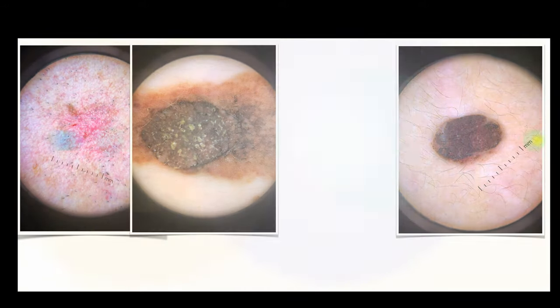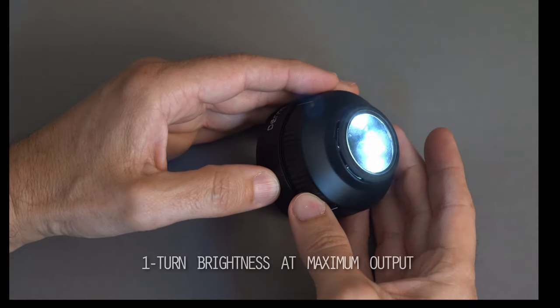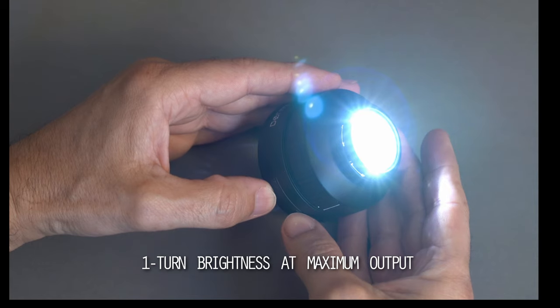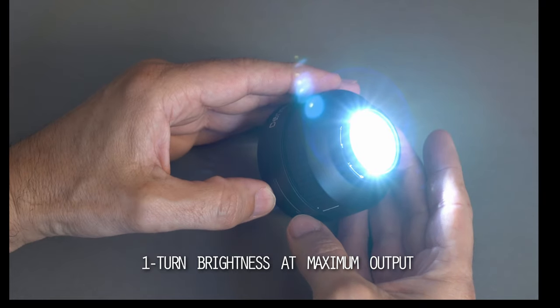To start off with, I would like to point out basic things that are very relevant to getting great results. First consideration: just make sure that you turn your dermatoscope to its maximum light output. Not all devices have this option, but if yours does, please remember to set it up correctly.